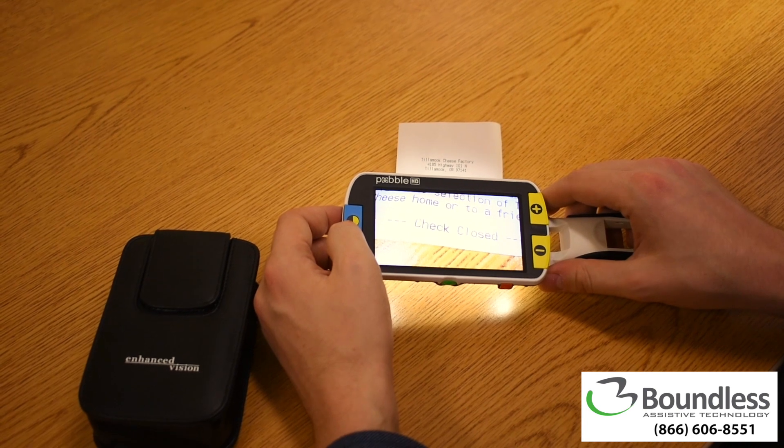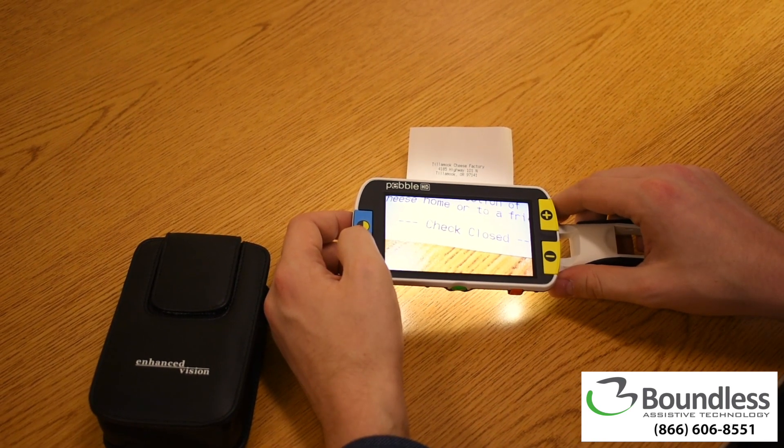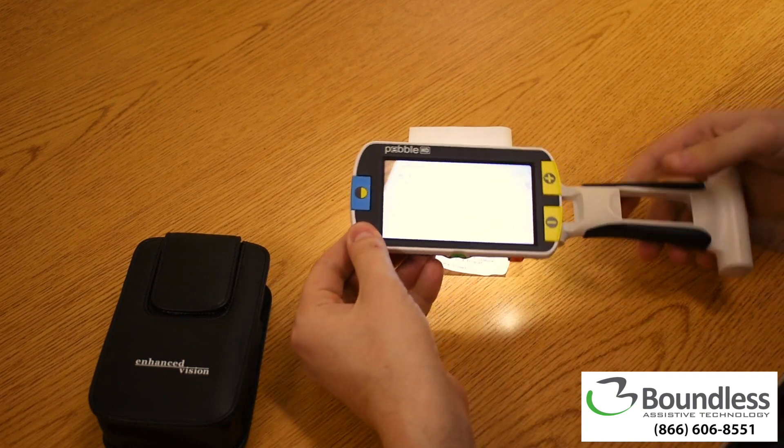Boundless AT is proud to show you the Pebble HD from Enhanced Vision. This is a 4.3 inch HD handheld magnifier with a solid feeling handle, providing for several methods of use.